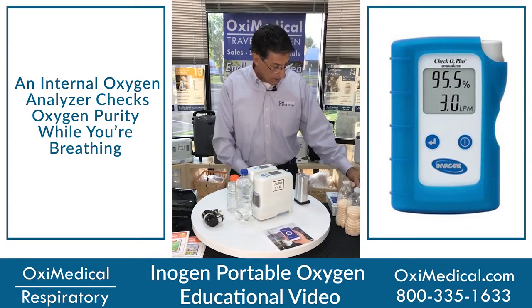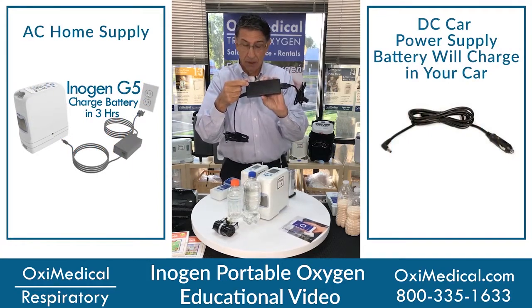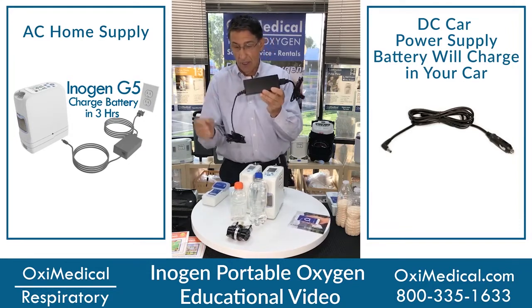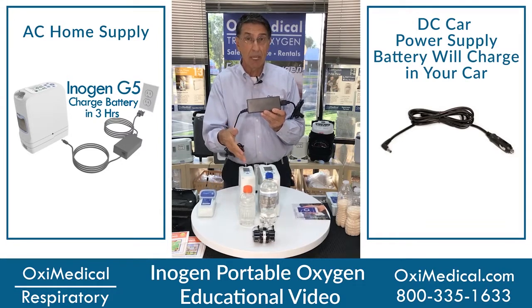They come with an AC power supply. And when you plug it into the wall outlet, you're going to get a green light here to make sure you're getting a good power source. And you have the round peg into the round hole. You can run the Inogen without the battery in it.